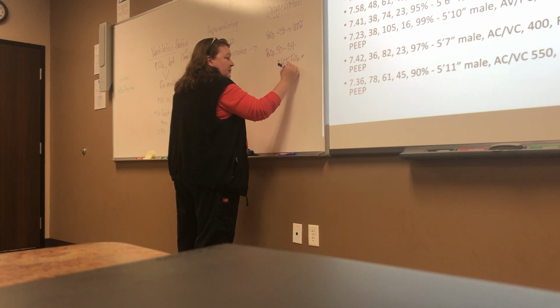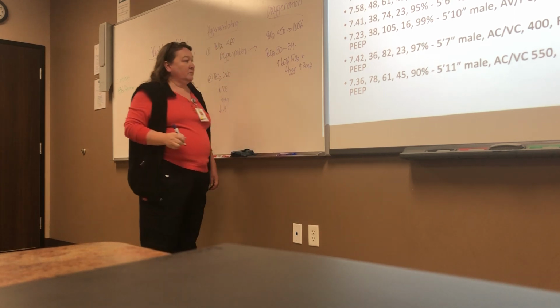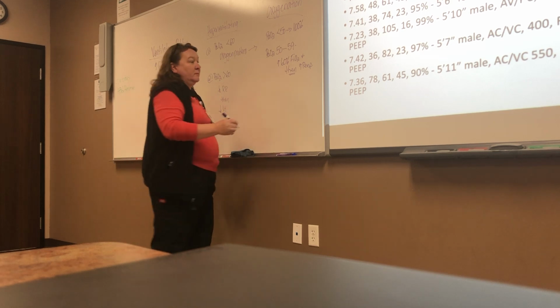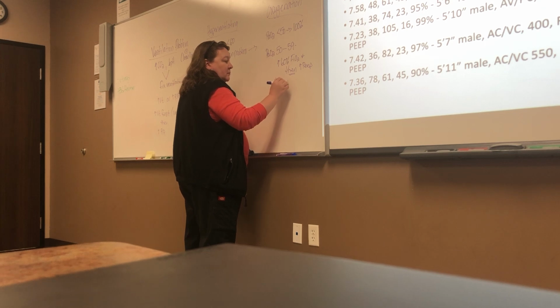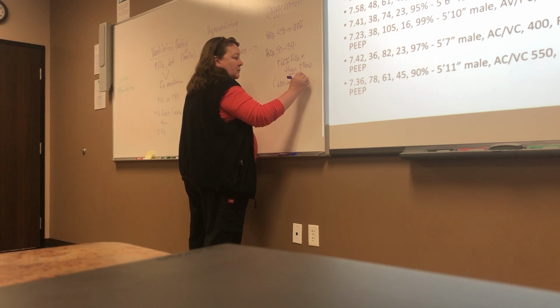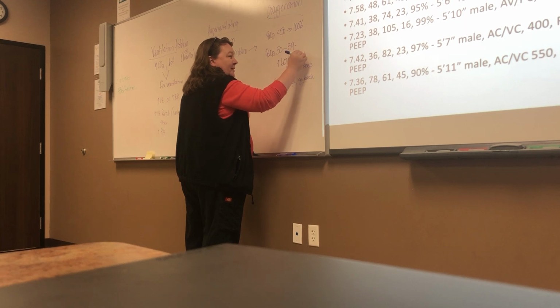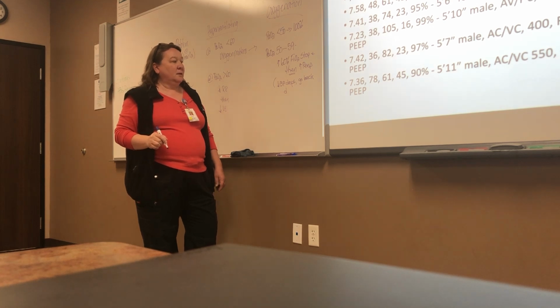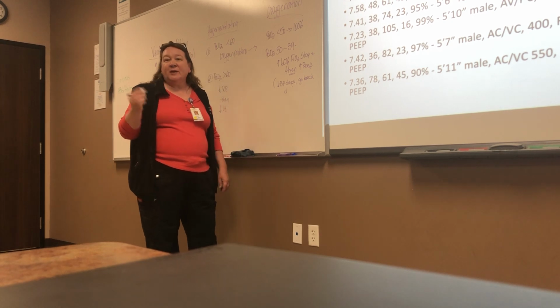and then increase your PEEP. Once you get to 60, you stop and you start on PEEP. Go to 60% FiO2, stop, and then increase PEEP. Repeat, usually, the increments that we go up are 3 to 5, really. It depends, but 3 to 5.